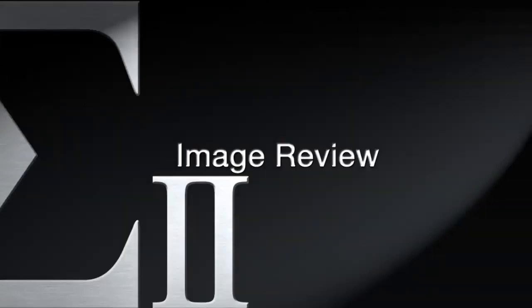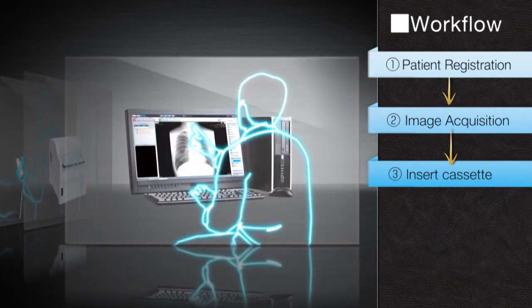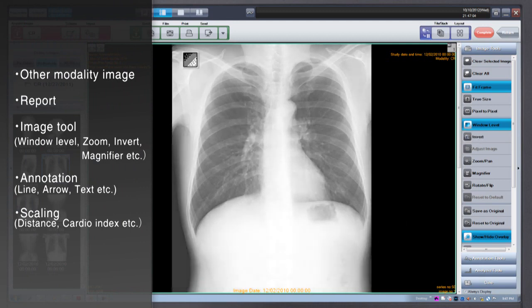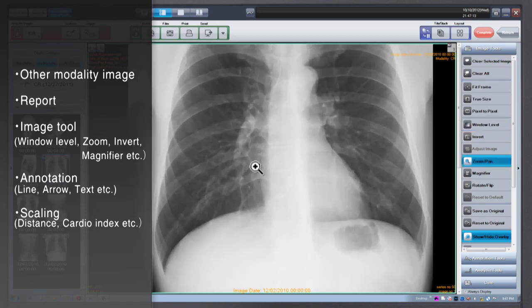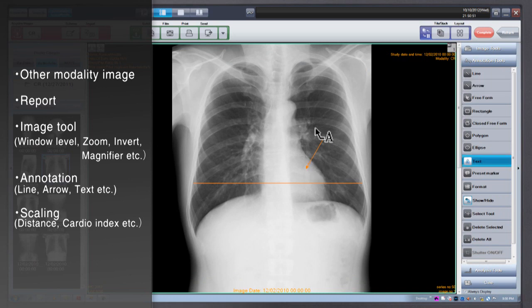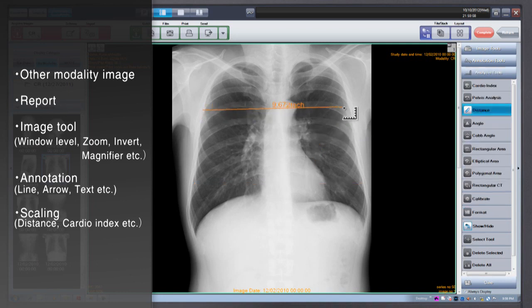ImagePilot supports many features and functions for image review. There are basic PACS viewing tools such as window level, zoom and pan, and annotation tools for drawing lines, arrows and text markers. Plus, ImagePilot provides various measurement tools supporting distance, area, and also cardio index, cob angle and pelvic analysis.